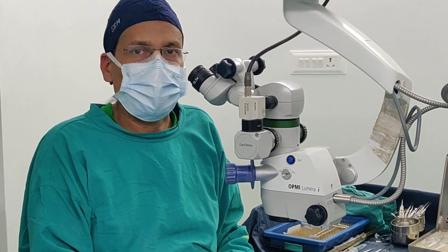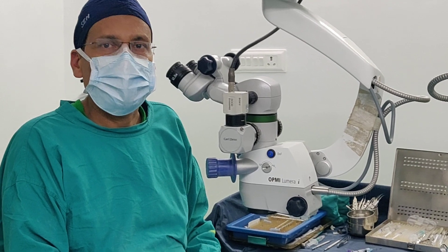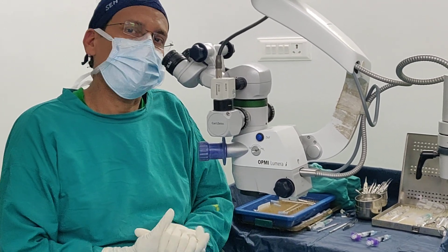Hello friends, I am Dr. Suresh Bhante and today I am going to show you implantation of the Technis Simplicity Delivery System.